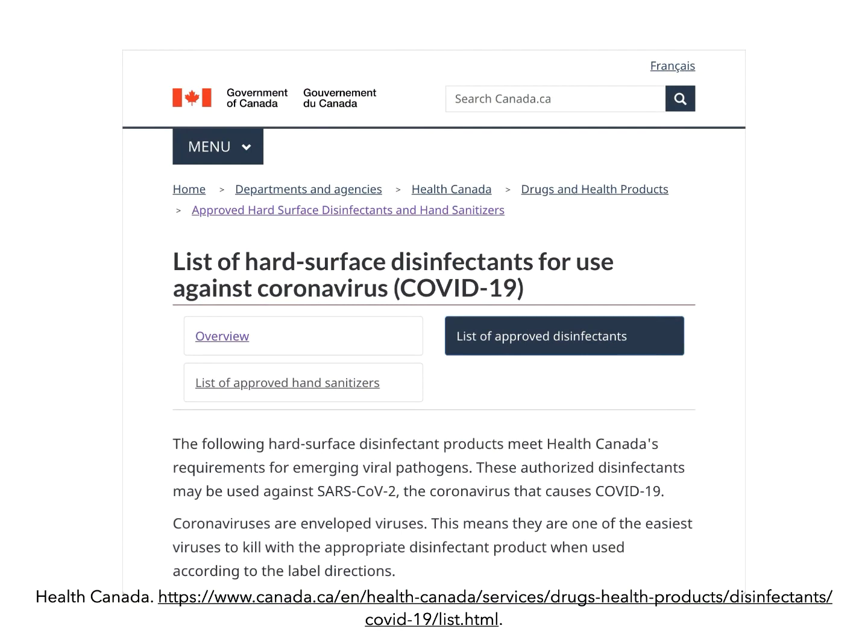Once you've completed your scan, make sure that you clean your gloved hands with hand sanitizer. Then remove any cover you have on your machine, taking care not to disperse viral contaminant, and wipe it down with an appropriate disinfectant.